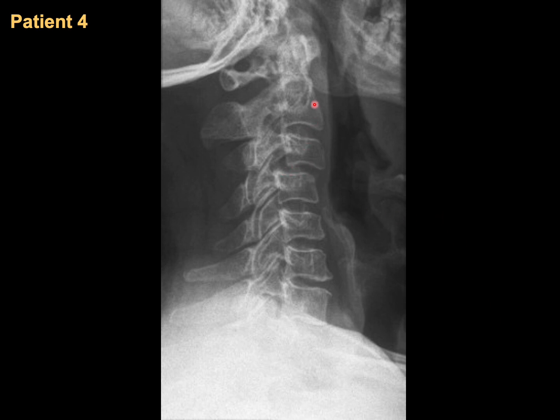Counting from C2 — which has the dens — this is C3, then C4. It is very clear that we are having a subluxation of C3 on C4.